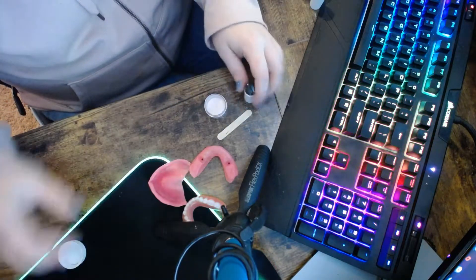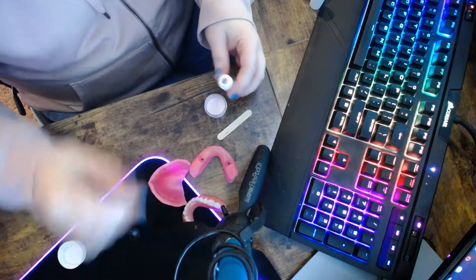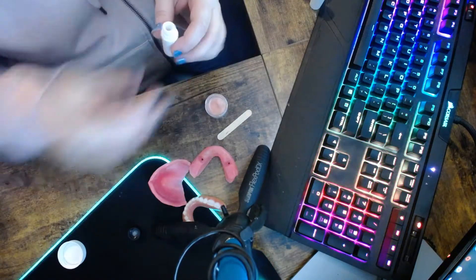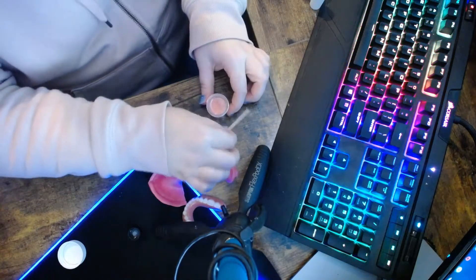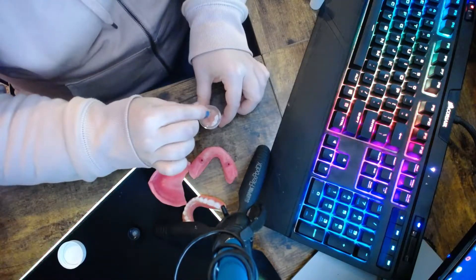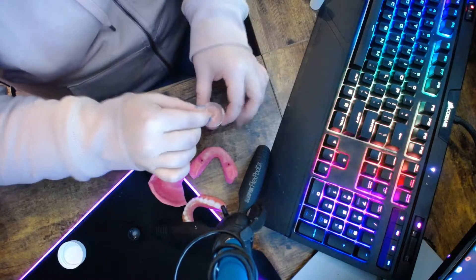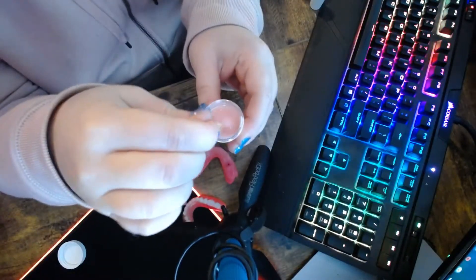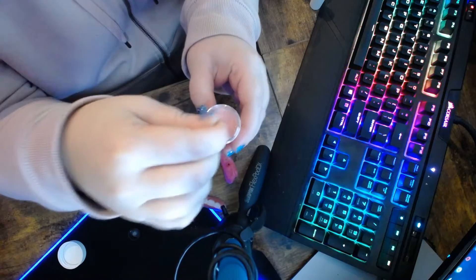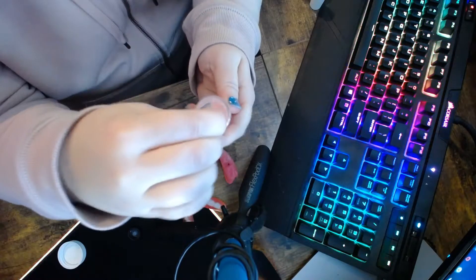We're going to go ahead and open this up. According to the directions, we just dump this whole vial in there, which is what we're going to do. And we're going to mix that up until it is slightly thicker than honey. Just go ahead and slowly stir that up so we don't get it everywhere. Right now it's very, very runny, so I'm just going to keep mixing it. Make sure to get everything off the bottom and mix it up until it starts to get thick.